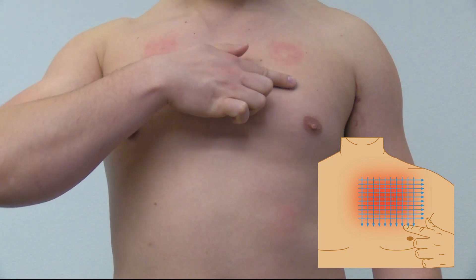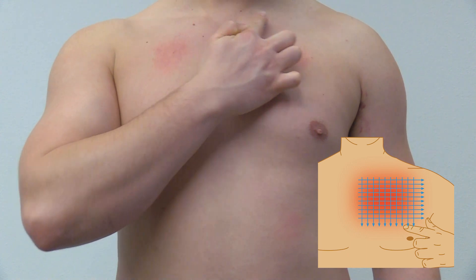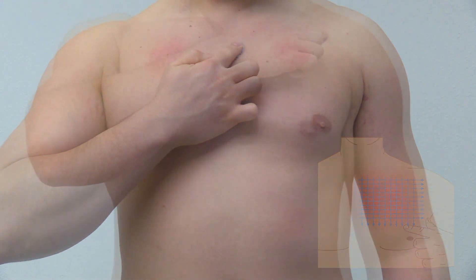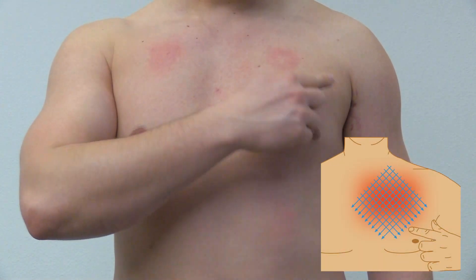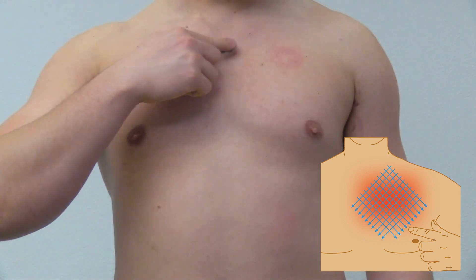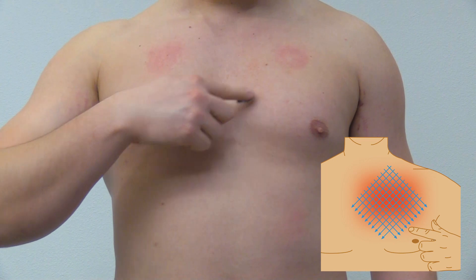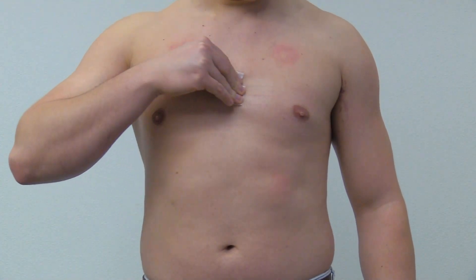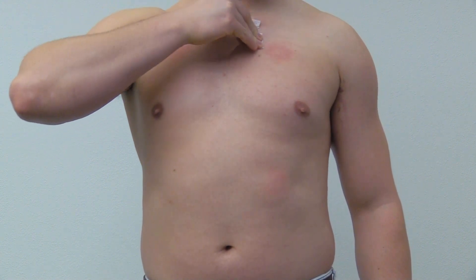Apply 10 vertical and 10 horizontal strokes, covering a large area of your left upper chest region. Then apply 10 diagonal strokes in one direction and 10 diagonal strokes in the opposite direction until the skin is fully abraded. Clean the debrided area a final time and allow the site to dry for one minute before applying the electrode.